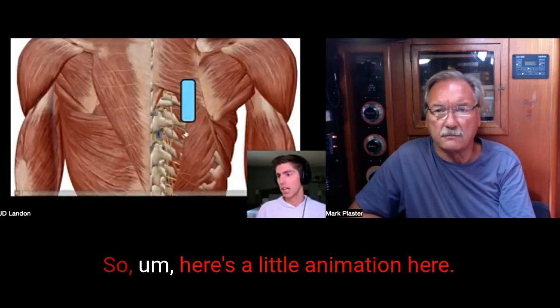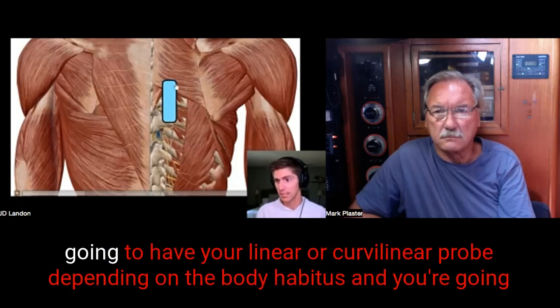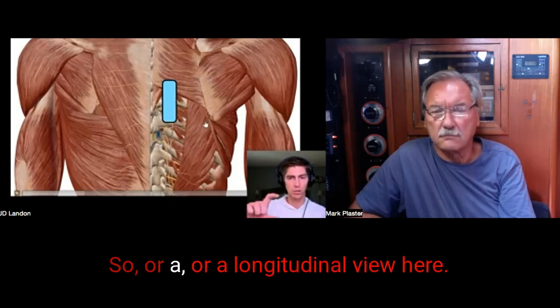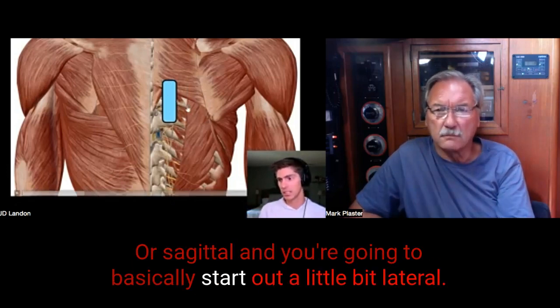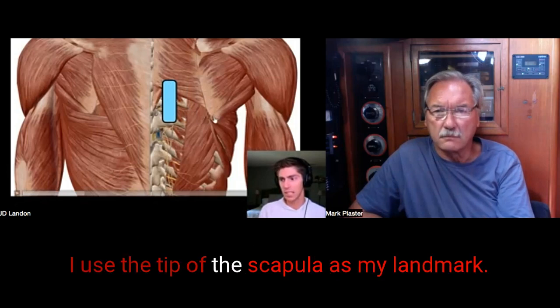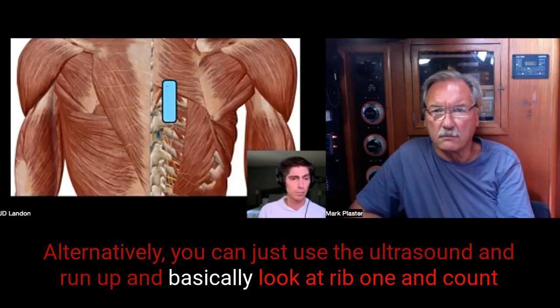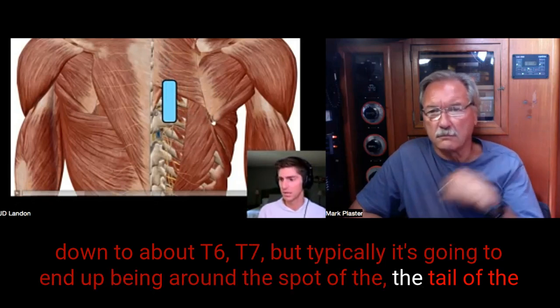So here's a little animation. The way we're going to physically do this is you're going to have your linear or curvilinear probe, depending on the body habitus, in an up and down, longitudinal or sagittal position. You're going to start a little bit lateral. I use the tip of the scapula as my landmark. Alternatively, you can use the ultrasound, run up, look at rib 1, and count down to about T6, T7. But typically it ends up being around the tail of the scapula.